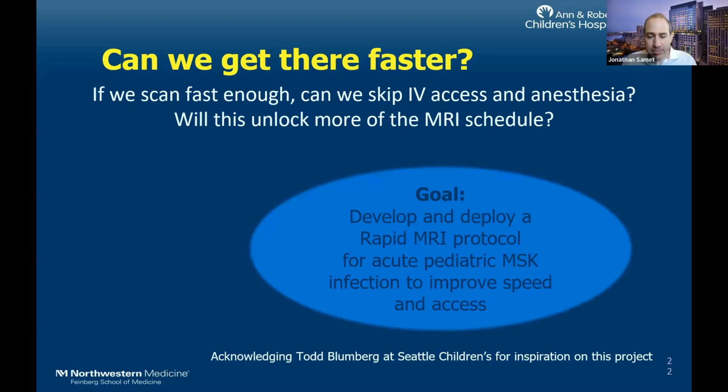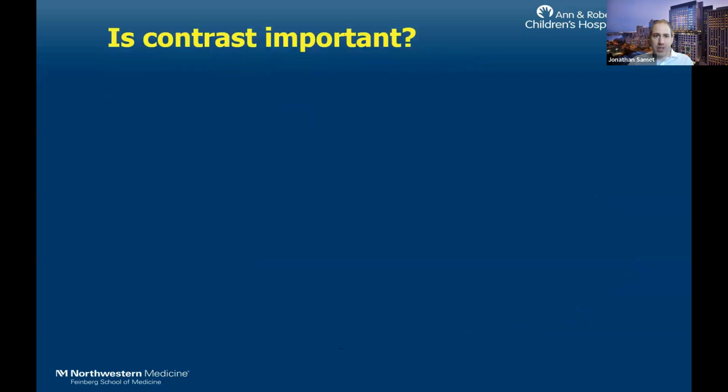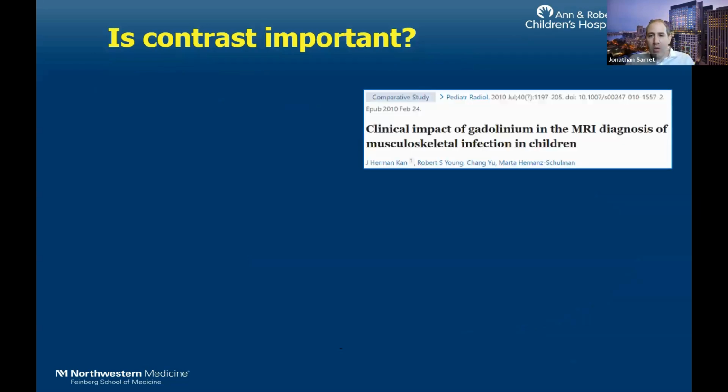So we had a goal, and this is what we went through in our paper, which is to develop and deploy a rapid MRI protocol for acute MSK infection in order to improve the speed and the access. So we ask ourselves, is contrast important, right? We know it takes a long time, but do you need it? Well, there definitely are some advantages to contrast, right?